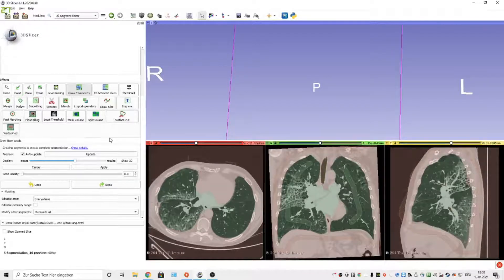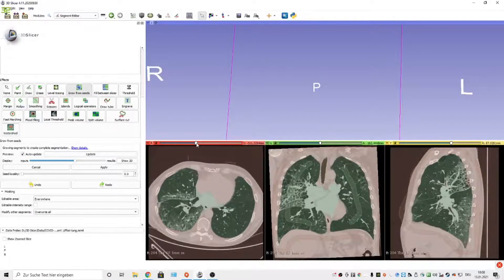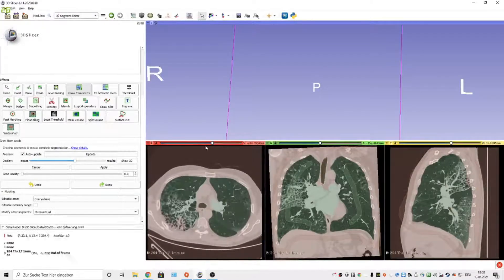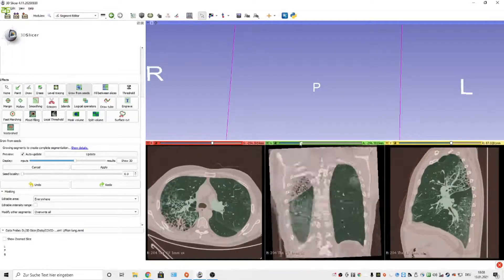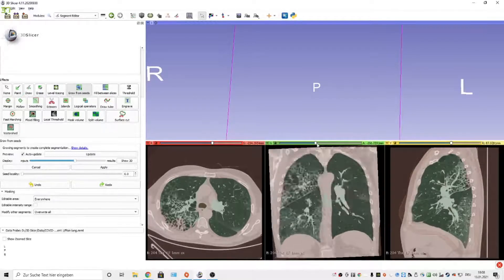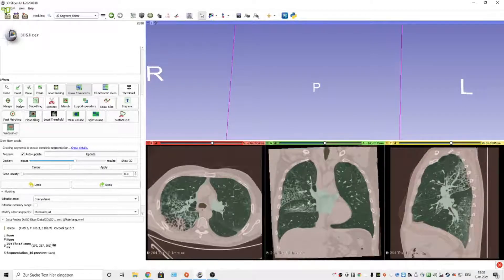Okay, now the initialize function has finished and we need to check and correct the results. In the right lung we have some missing areas. The left lung looks okay to me, but there's a big leak in the area of the heart — a leak from the lung.